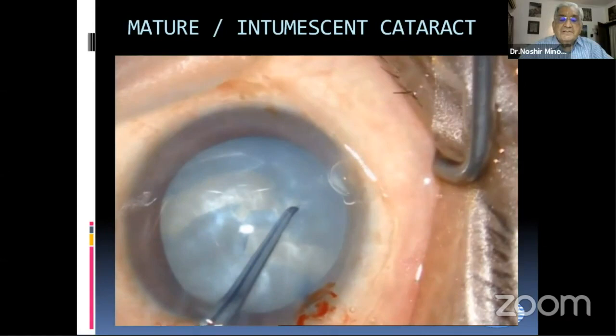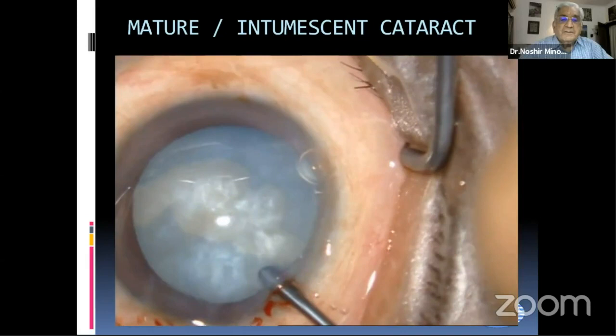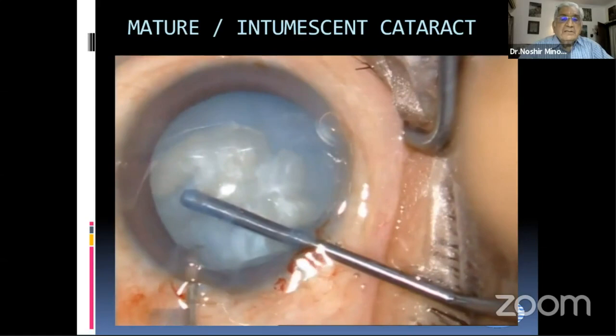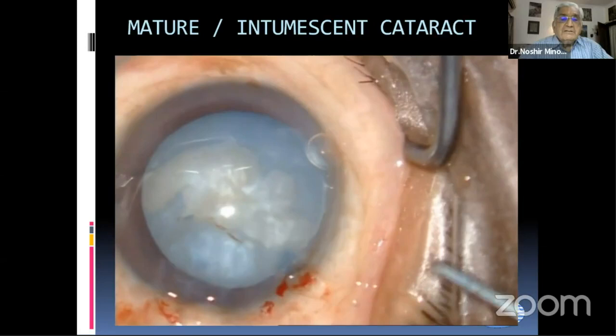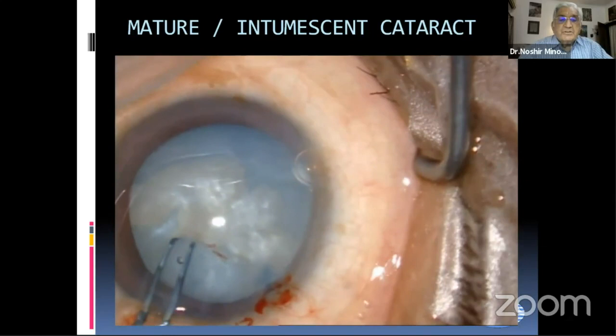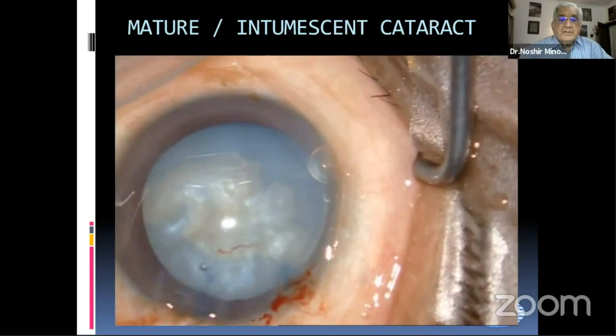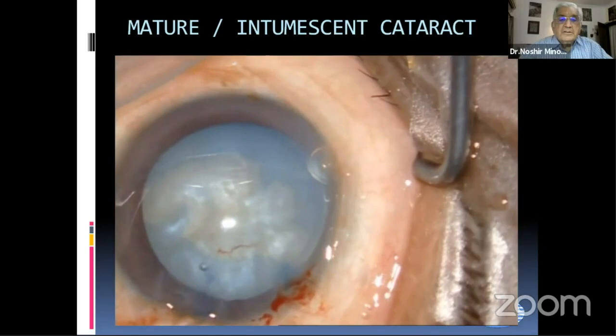By the time we made a nick, it spread on the other side like an Argentinian flag sign. So we complete this capsulorhexis. We don't have adequate space, so we try to create space to do the phaco emulsification. We have a little tag which we cut later, but before that we make a nick in the capsule with a spatula behind it and then with the needle, and then exchange the viscoelastic so that we now have adequate space for the phaco. And this tag can be cut.